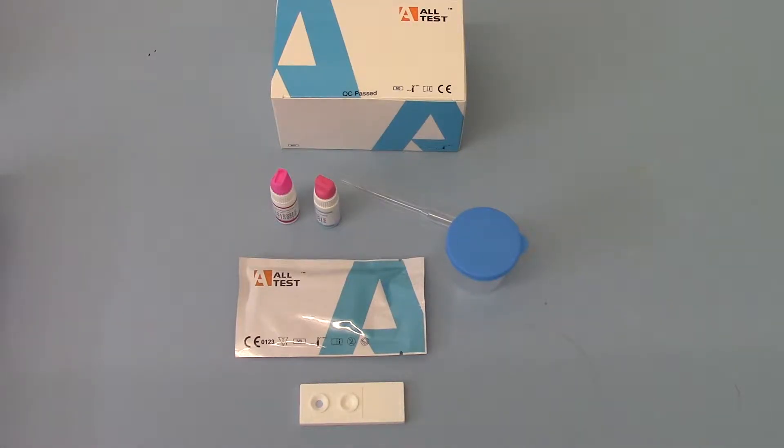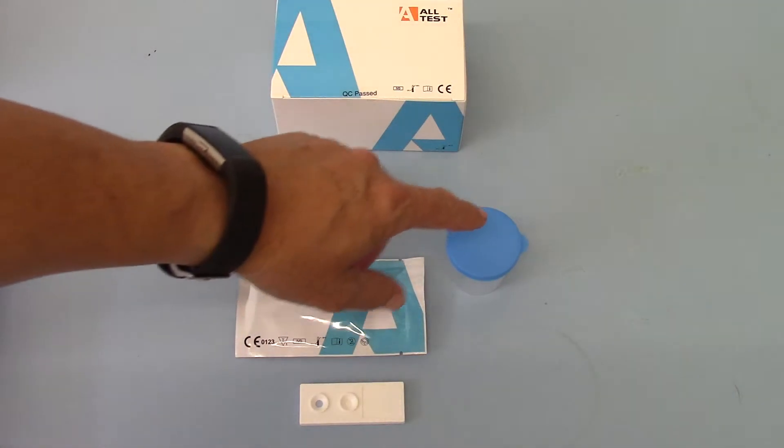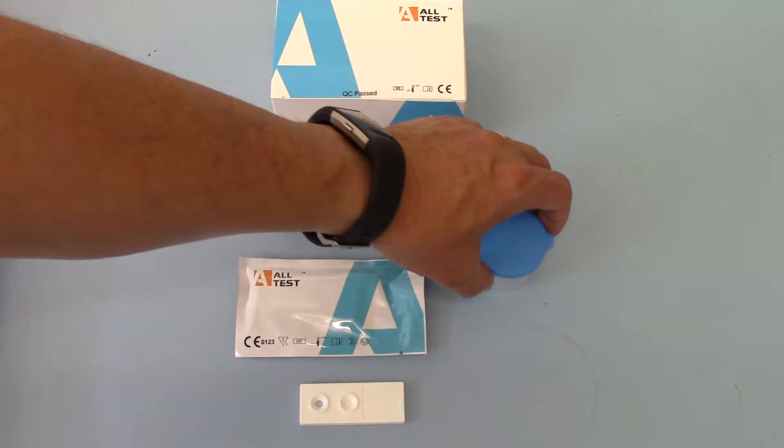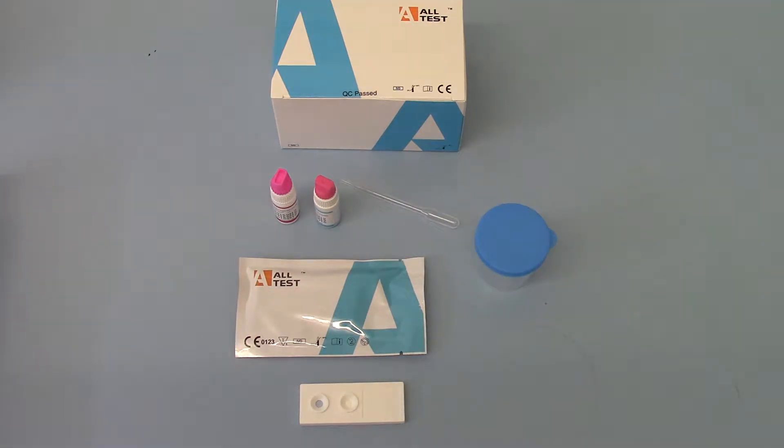So the procedure for running one of these tests is to masturbate into the pot here, replace the lid once the ejaculate is in the pot and leave to stand for between 15 and 20 minutes.